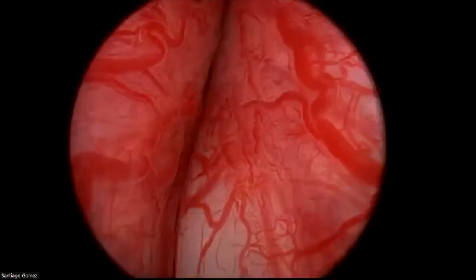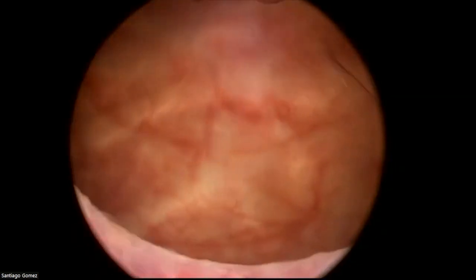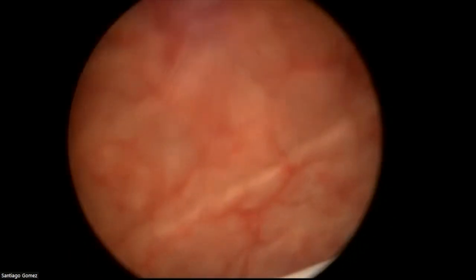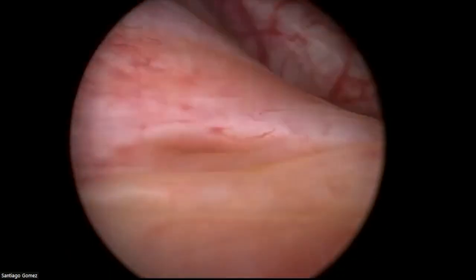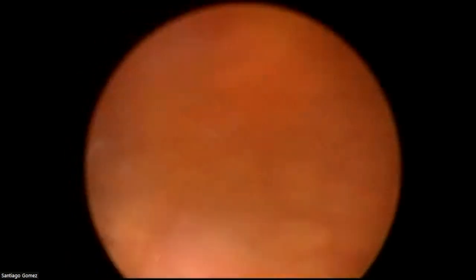So here that is probably a cyst. That's a prostate, so it's again a relatively bulky case. And sometimes you have to push a lot if you want to see the ureteric orifices. So I don't stress it too much because I can see them later, but they are close to the bladder neck, so we have to be careful. You can see it's a trabeculated bladder, but not too bad. Okay, vamos a la fibra.